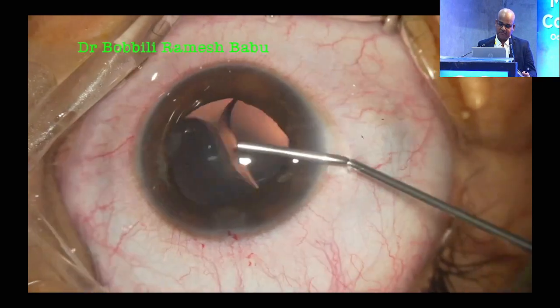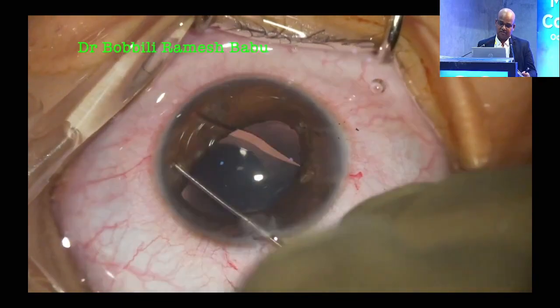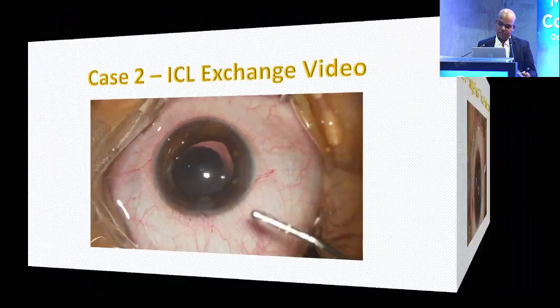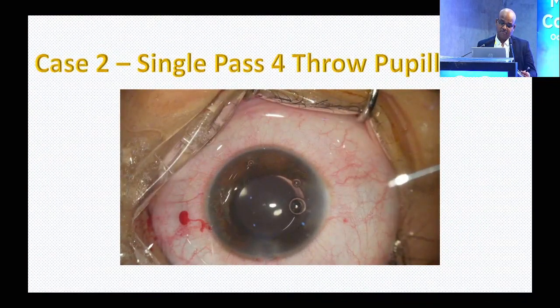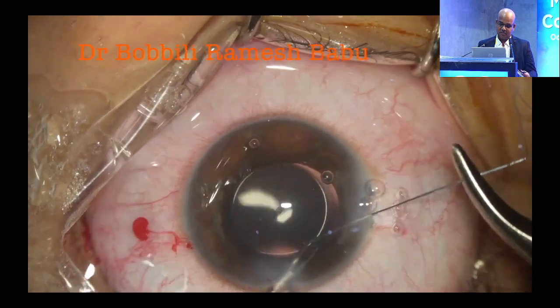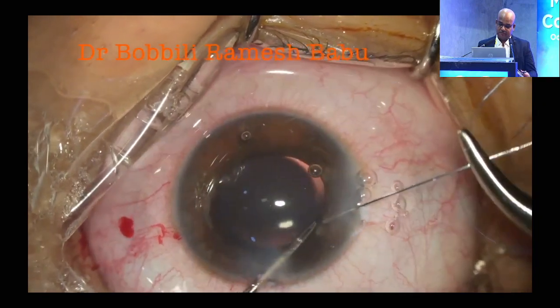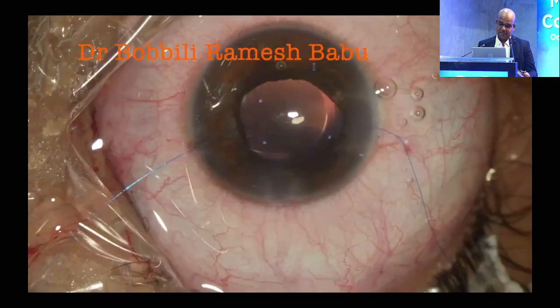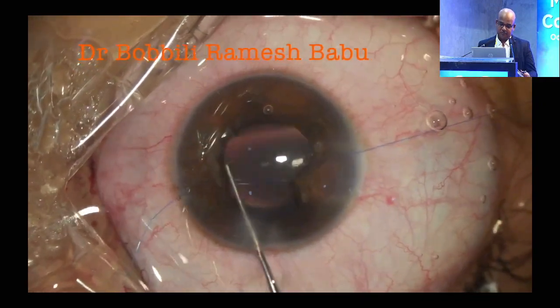This is the explantation. Again, we are doing it in a similar manner. It is the same thing done. But because there was an atrophic iris, the pupil was not reacting optimally, especially temporally and superiorly. So we decided to go with a single pass four-throw pupilloplasty, even after exchanging the lens. This is how it is being done. We are following the same Amar Agarwal's technique in a similar manner to get the pupil round.